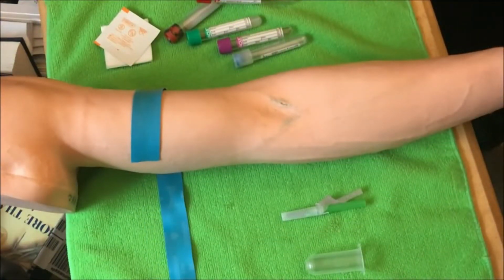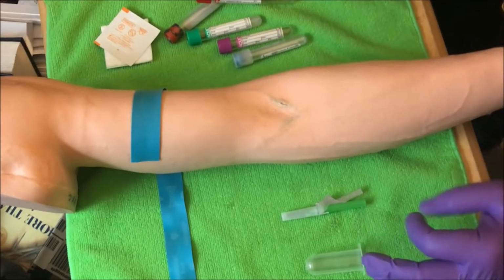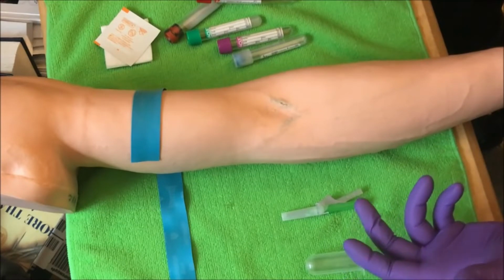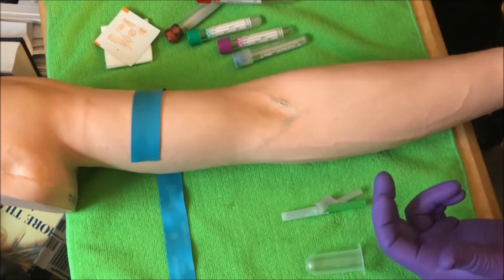Let's talk about palpating the site, vein locating. Let's talk about getting the site ready. Of course, we're talking about anchoring the vein. We just talked about assembling the needle, the order of draw, the tubes, and of course, let's get into the whole process of how we do this. Now, a couple things you understand. There is always a right and wrong way to draw blood, specifically the order of draw, the order of veins.